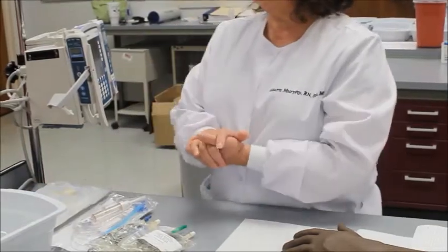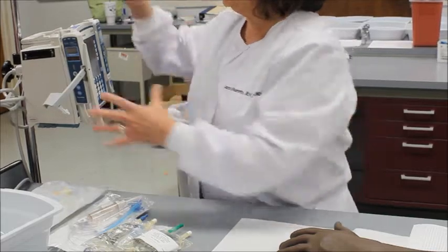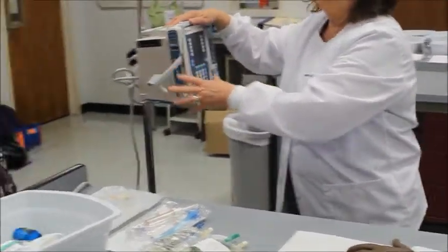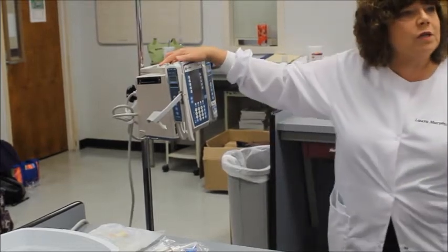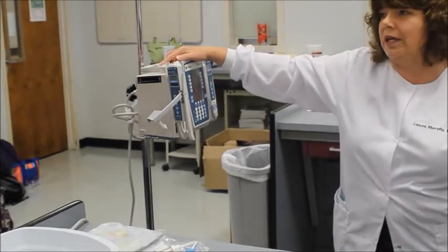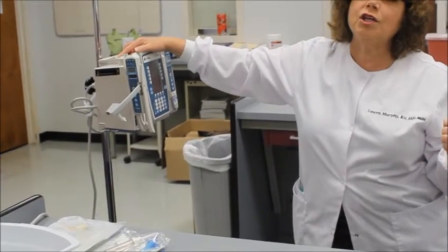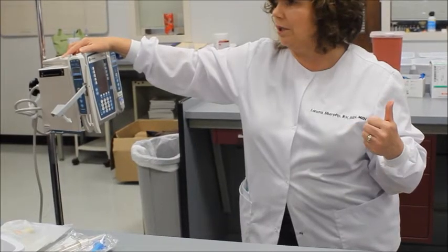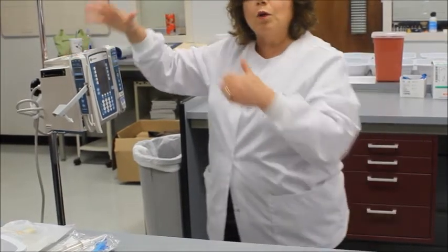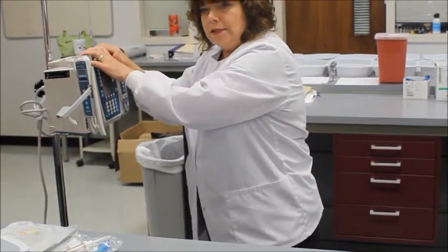Now then, certainly to even gather my supplies and everything, I wash my hands. Now, none of us next semester are going to typically have you setting up your fluid at your patient's bedside. Okay? Because your patient will get uncomfortable if it takes you 20 minutes to set up your fluids. All right? So we're going to be somewhere and prime our lines. Okay?